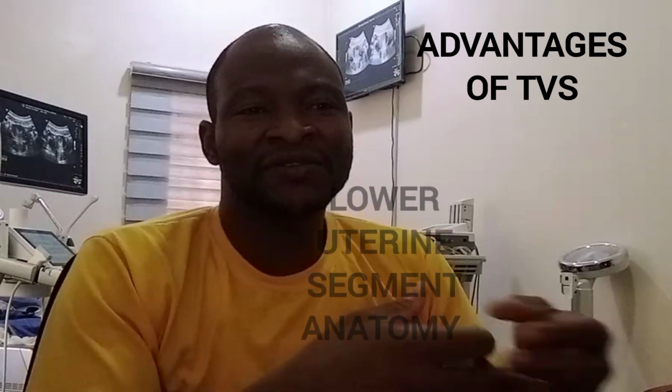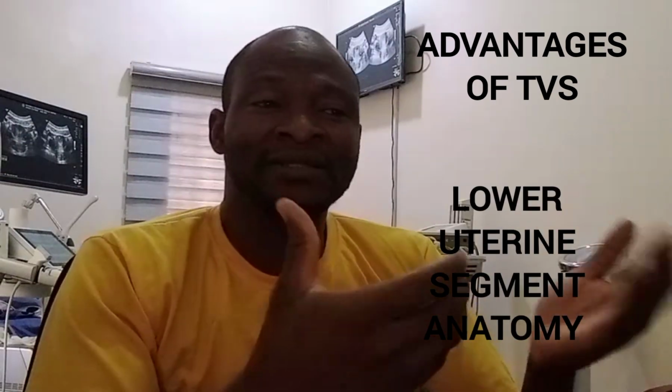TVS will permit better visualization of the cervix and lower uterine segment for diagnosis of cervical incompetence and issues like placenta previa. Now, TVS will be considered an intrusive but non-invasive technique.